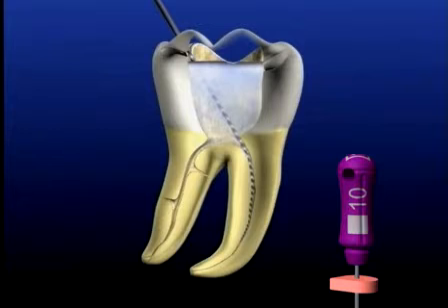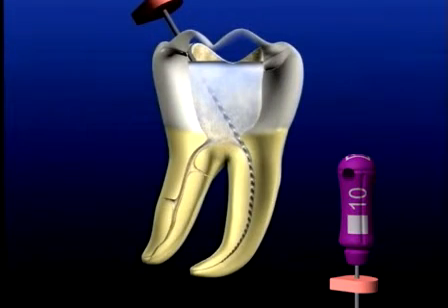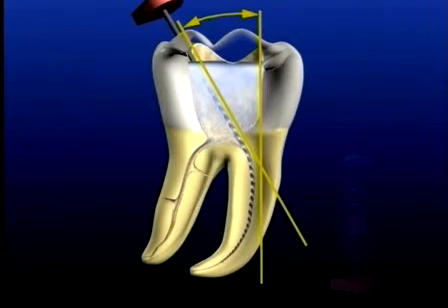When it's snug, we pull, and importantly, we're cutting on the outstroke, away from the terminus, and out of the canal. Generally, about 6 feed-in, pull-cutting cycles achieves a smooth and reproducible glide path. When scouting the coronal two-thirds of a canal, clinicians need to be aware of the handle as it relates to the long axis of the canal.